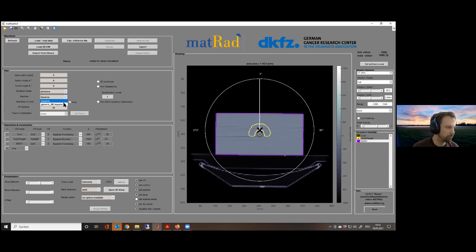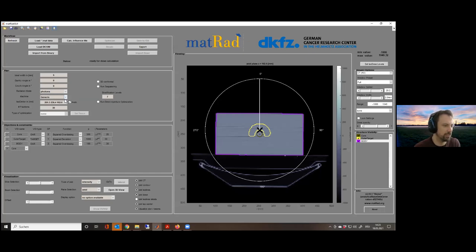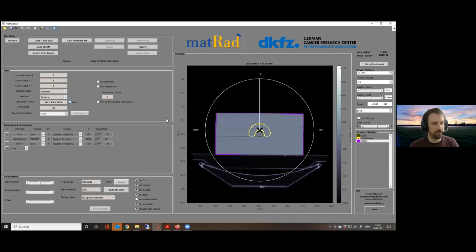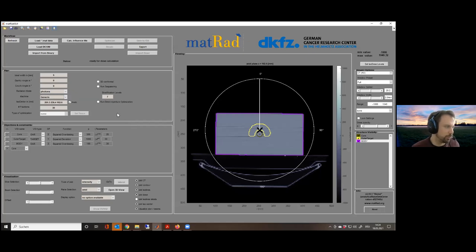When I trigger the 'visualize plan beams' button, you can see which gantry angles are currently set — there's a zero-degree angle falling directly into the isocenter. This comes from the plan parameters widget: default settings created when you load data. It gives a zero-degree gantry angle, zero-degree couch angle, and sets the radiation mode to photons with the generic machine. Please stick with the generic machine — do not use others.